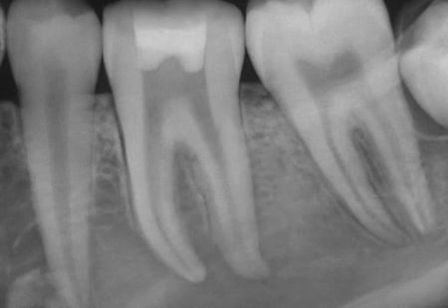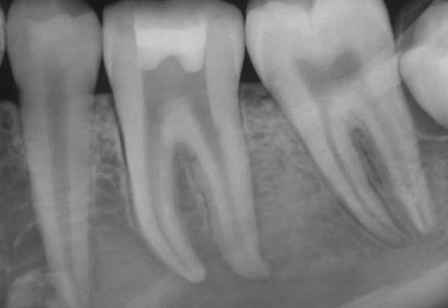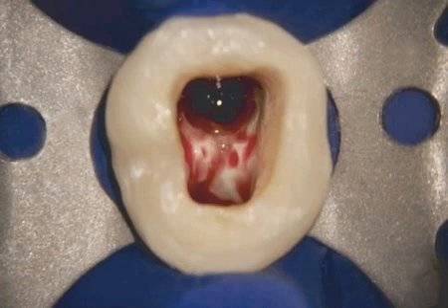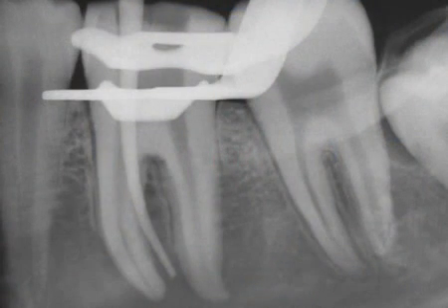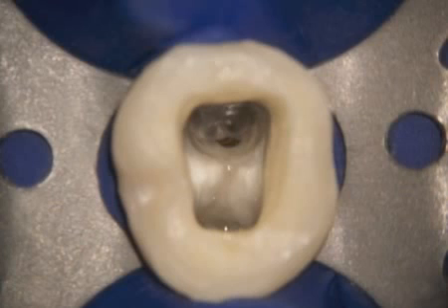This patient was involved in a car accident, and their general dentist opened the first molar on an emergency basis. The mesial canals appear over-enlarged and possibly perforated. Clinically, upon re-entry, massive bleeding was noted coming from the mesial systems. A gutta-percha cone is placed down the mesial root and demonstrates the massive defect. The bleeding was progressively controlled with calcium hydroxide.